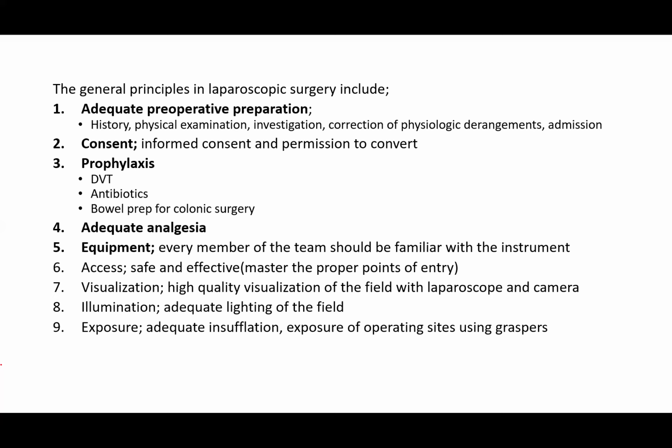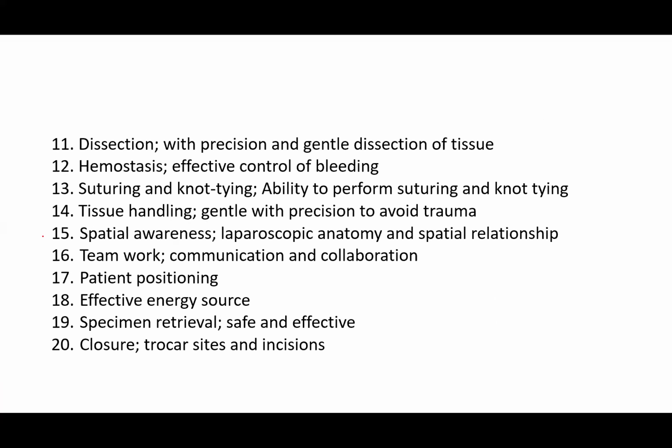Then exposure of operating sites using graspers. To get access to the organ you want to operate on, you need graspers to clear the field, all the bowel or other structures that are covering the structure you are heading to.